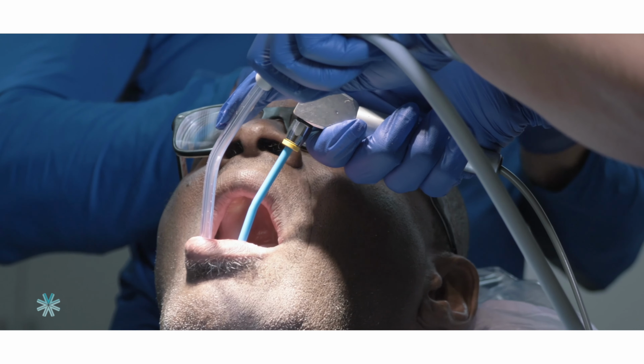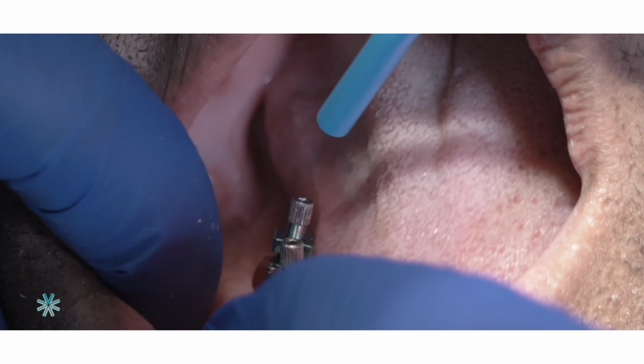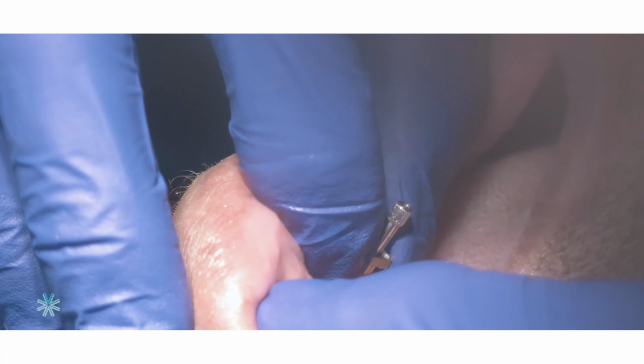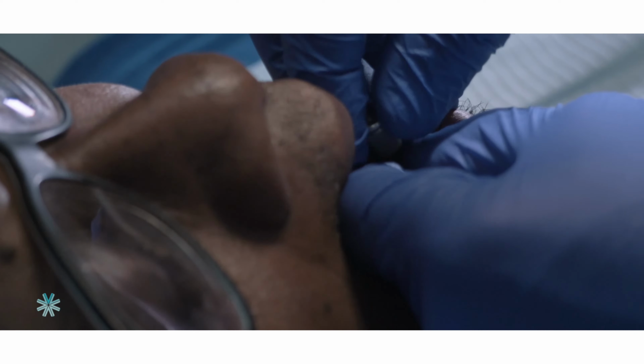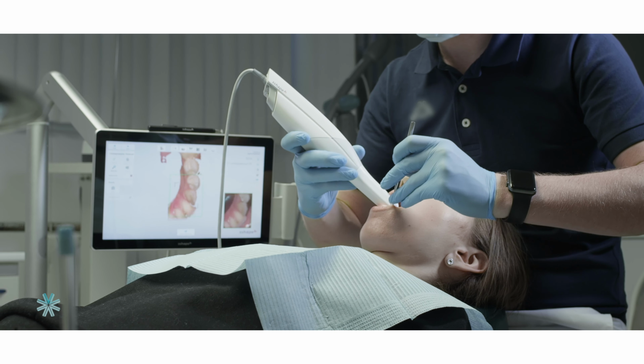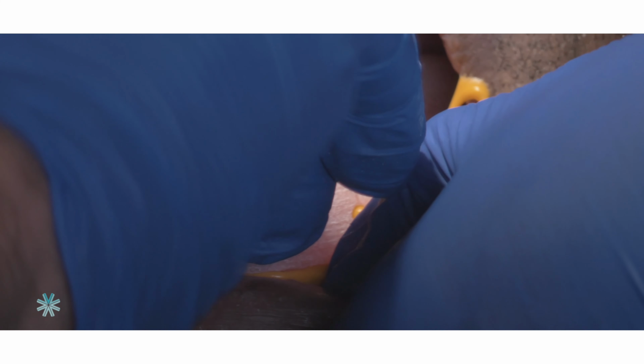The alternative traditional method for taking an implant impression would be the analog method with PVS impression material. And instead of a scan body, a doctor would use an impression coping. Now, the impression coping and the scan body both effectively do the same thing. So the doctor would take a scan body or an impression coping and screw it into the actual patient's implant. And then they would either take a scan of that scan body in place after they verify that it's fully seated, or they will take a PVS impression encapsulating the impression coping.